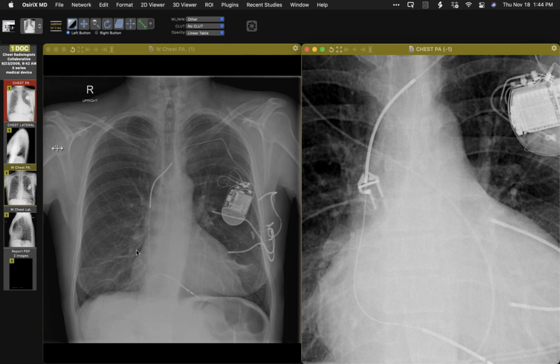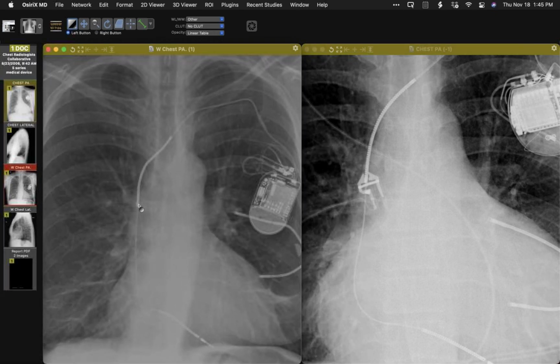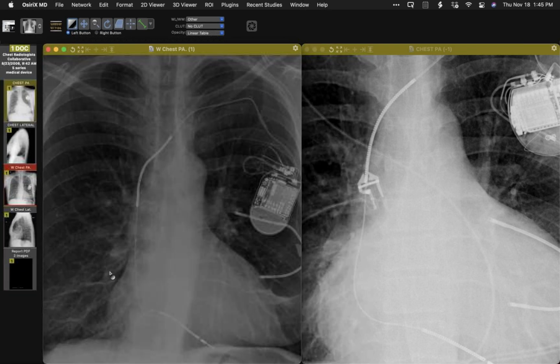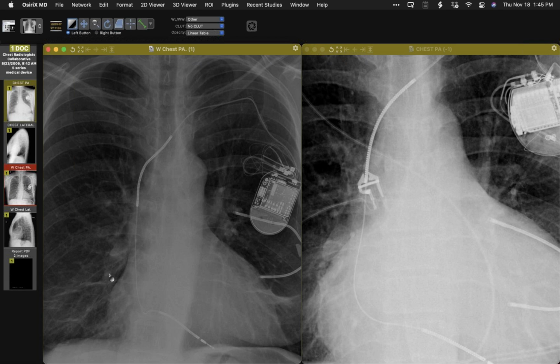Jeff, you're right. I mean, this is something that occurred in the past, but that's because I think they've taken out most of these leads, or the patients have died. Right. But this is an old case, so this fits the time frame that you're talking about. Okay. I just wanted to make sure. I mean, because that's what I thought. They either took them out or, like you said, it's been not quite 10 years, but I just haven't heard them mentioned before. I haven't seen another case. I haven't had a request to look at any leads. Yeah.